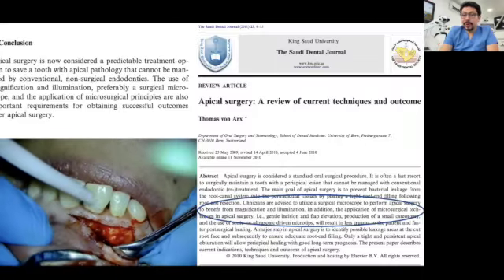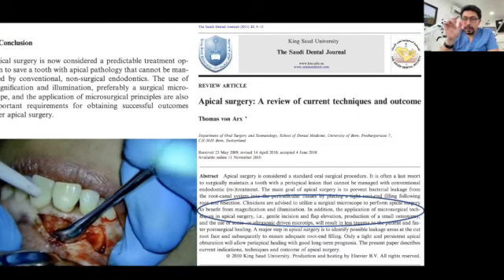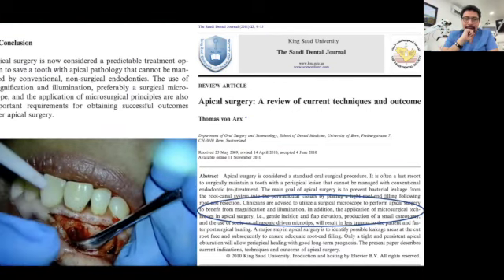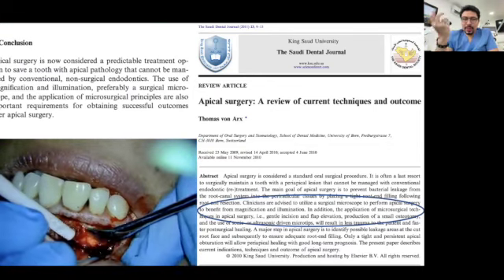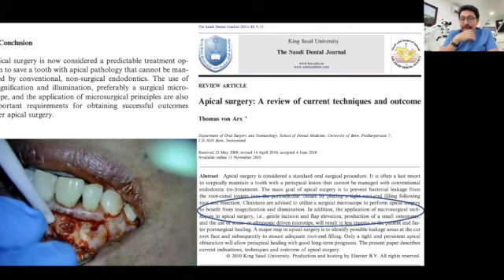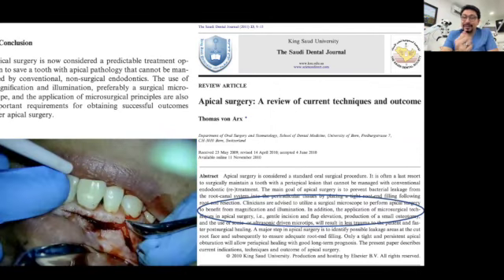So as you notice, we were able to perform a very precise treatment, but the focusing, the depth of field will reduce as well. As you know, we have many new devices in the market related to digital dentistry, but when we analyze the success rates before any new technology and what we used to do, most of the times you will notice that the success rate is the same. Most of the advantages of having this technology are related to the comfortability of the clinician. Now it's much easier to be a dentist.